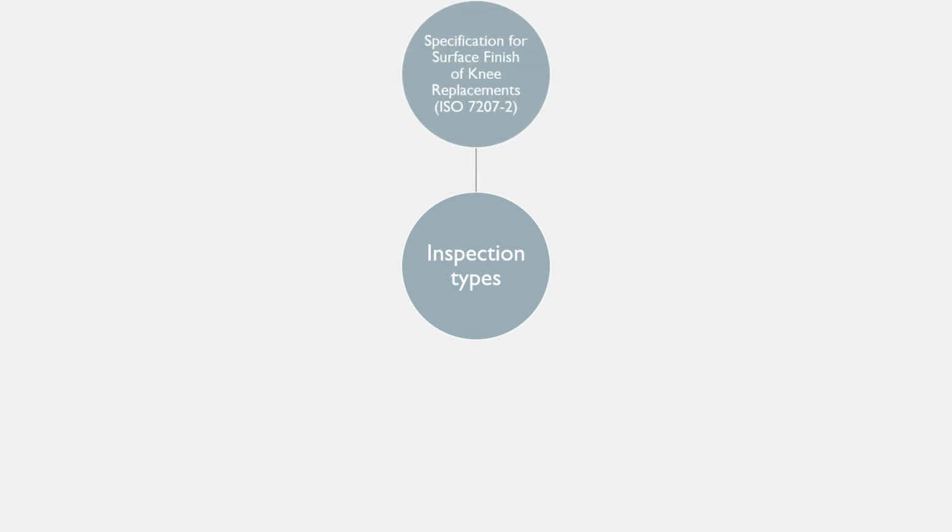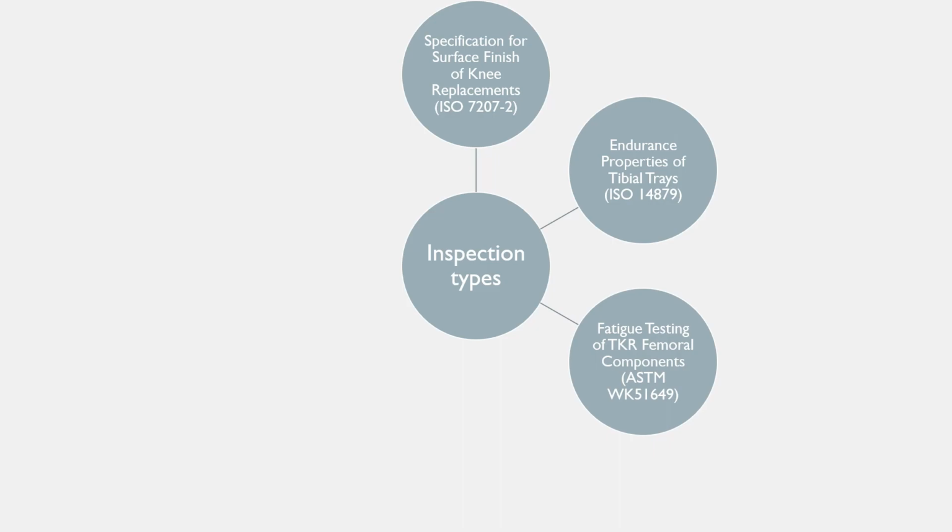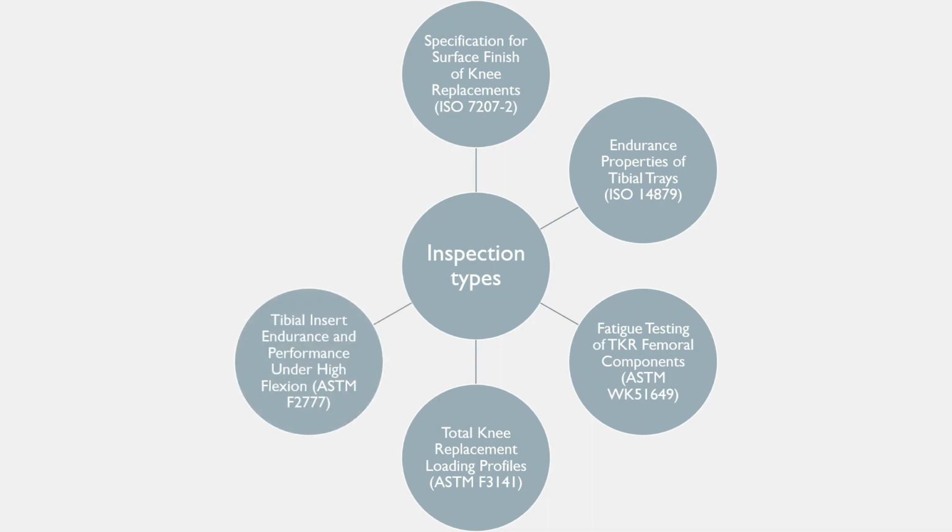Specification for surface finish of knee replacement. Endurance properties of tibial trays. Fatigue testing of total knee replacement femoral component. Total knee replacement loading profiles. Tibial insert endurance and performance under high flexion. Guide for evaluation of modular hip and knee implant.